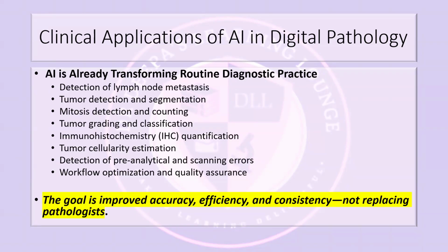Another important area where AI will assist is tumor grading and classification. If you're analyzing the architectural patterns, let's say for prostate, then you are looking at the nuclear morphology and the histological features. In this also, the AI can support the grading systems because you've already fed it, you've validated it, and your system knows how to grade it. Then it picks up very well and reproduces the same data properly. And these tools are very important for decision making.